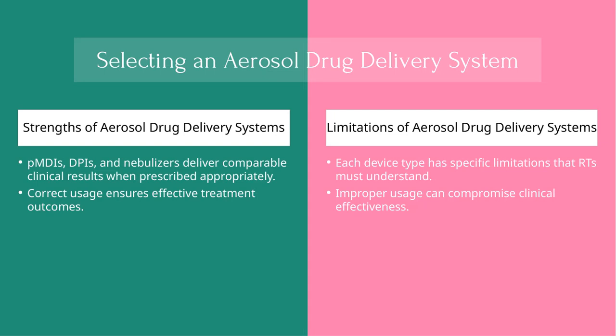Now, let's look at slide 27, which provides a comprehensive overview of aerosol drug therapy and nebulizer technologies. First, it's important to understand that PMDIs, DPIs, and nebulizers all deliver comparable clinical results when they are prescribed appropriately. The key here is proper device selection and correct usage. When used correctly, each device can be effective in managing respiratory conditions.